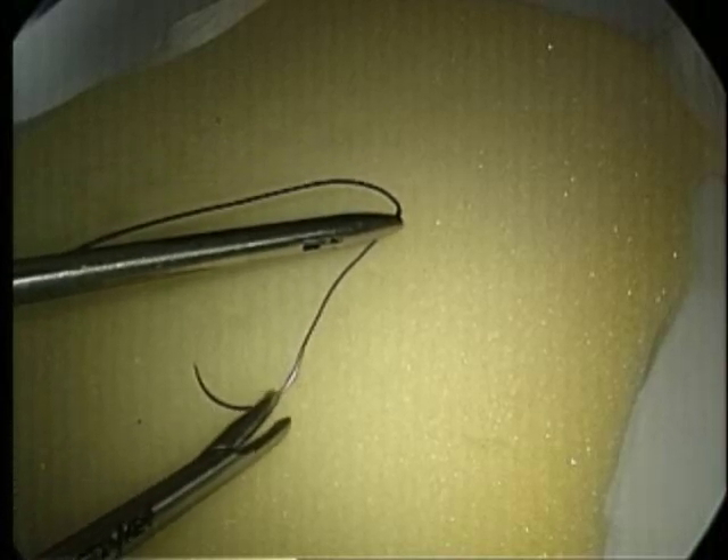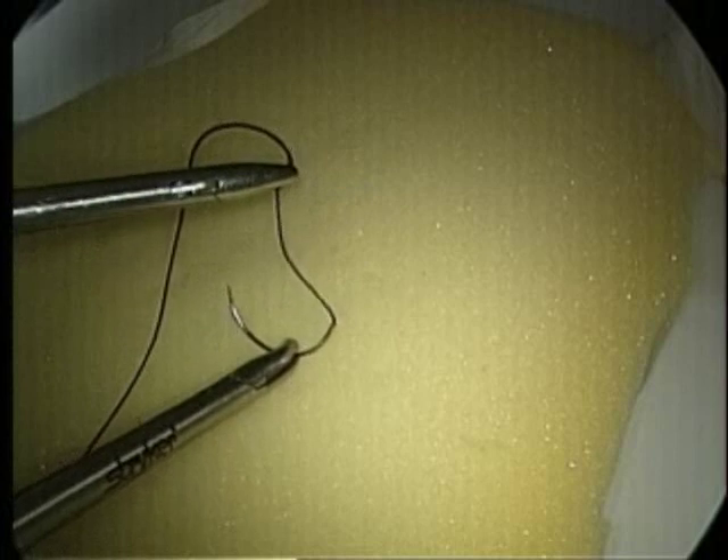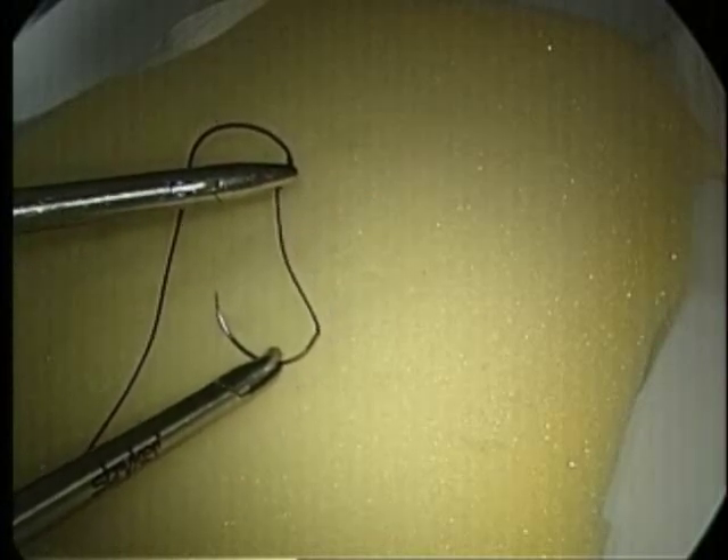For a right-handed person, the suture will be grasped with the left hand 3 centimeters from the swedge, and with the needle tip to the left of the needle swedge. The suture is introduced through a 10 millimeter port.